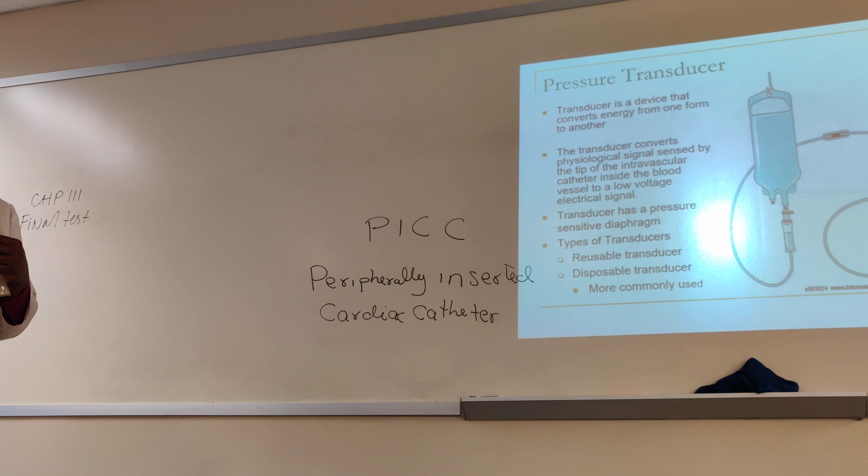And then we have reusable transducers, and then we have disposable transducers. It used to be, a long time ago, that if a patient got discontinued from using one of these, we could sterilize it and use it on another patient.